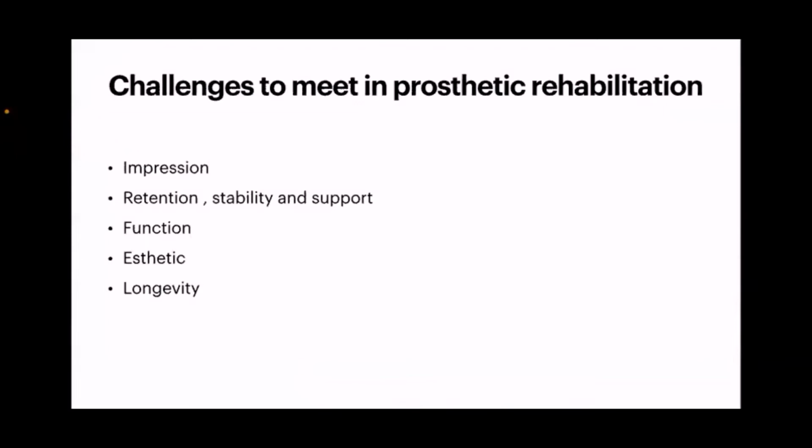Anatomical, as we discussed, by slightly modifying the surgical modifications to take the retention from the remaining teeth, hard palate, and soft palate. Retention can also be taken from the lateral scar band. And in cases of unfavorable defects, even the anterior nasal aperture works as a great aid in giving retention. Mechanical support and retention can be taken from clasps, magnets, implants, and a few adhesives.